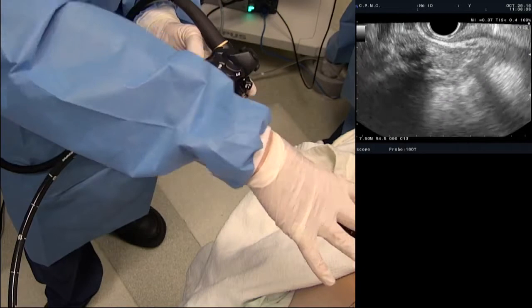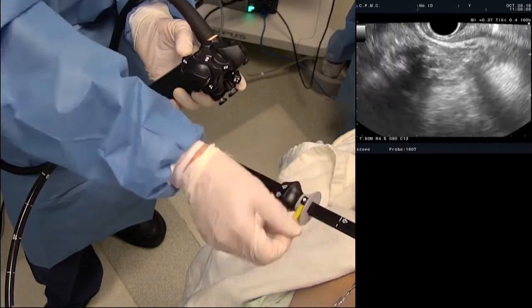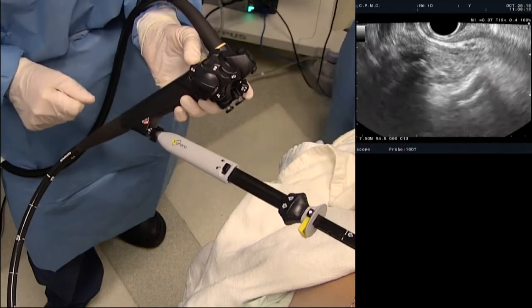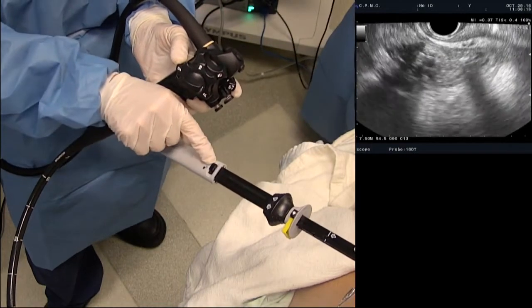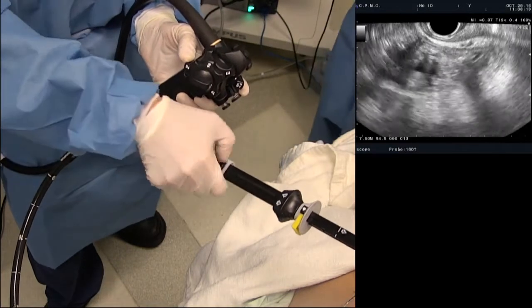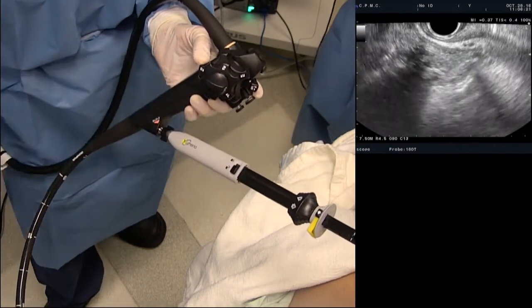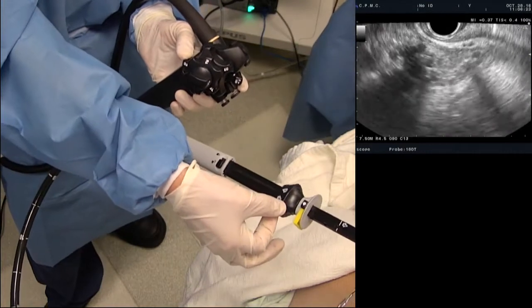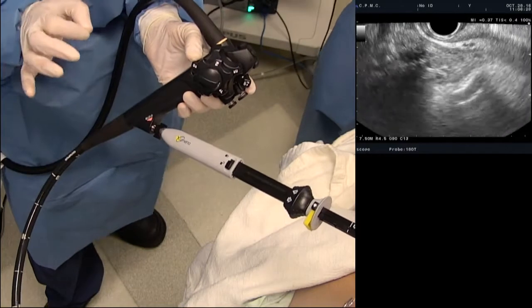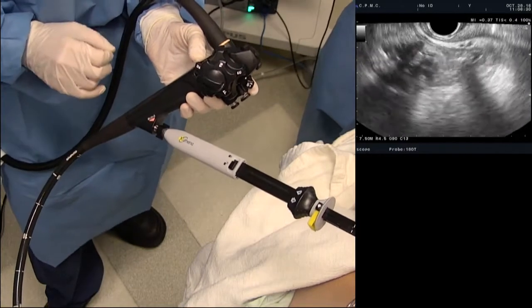And we're using this part as an FNA needle. This is no different than our FNA needle that we advance into our target. We do have it currently locked to prevent accidental advancement, so we have to unlock it first. But our first step is just going to be to advance the delivery sheath, and we're going to apply cautery to enter into the gallbladder.